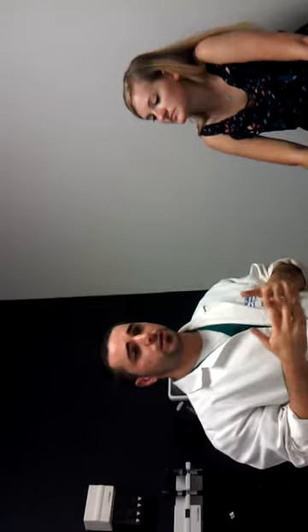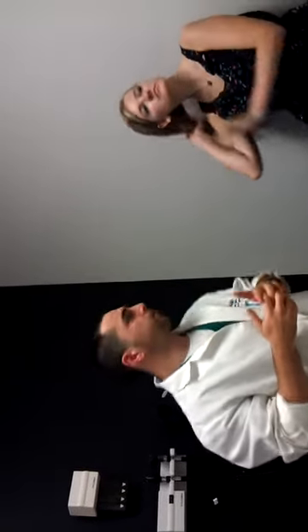Moving on into the internal structures of the nose, hair production is evident, and no signs of drainage or unfamiliar exudate. I visualized the anterior and posterior chambers. They were intact. There are a few vessels and no peripheral deviation of the nasal septum.